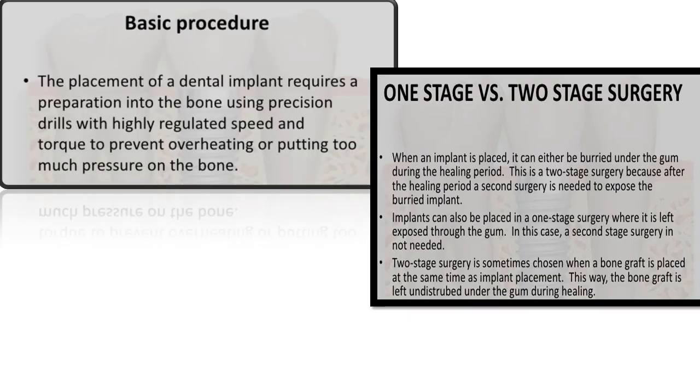Now let's move on to the dental implant materials, or the available options for dental implants. We can classify them into two groups: metals and ceramics. The metal options are commercially pure titanium and an alloy of titanium, which is Ti6Al4V. We studied both of these in the previous lectures, and then cobalt based alloys. Now, the other group is the ceramics, which are non-metallic.